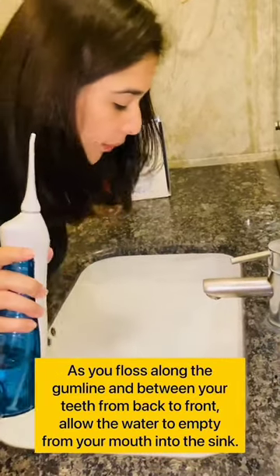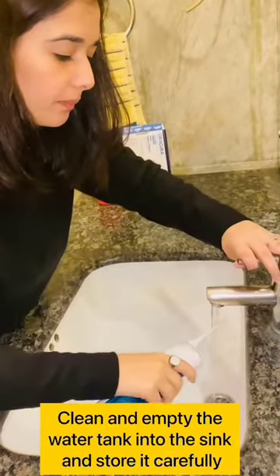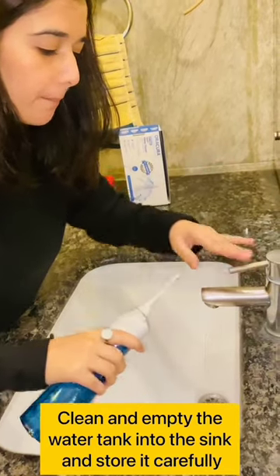You can do it from all sides, and then at the end, clean and empty the water tank into the sink and store it carefully.